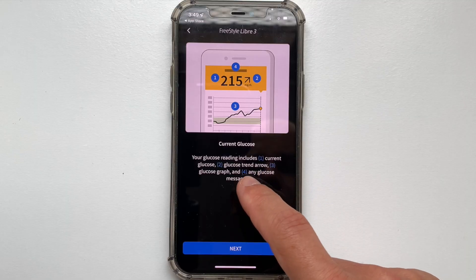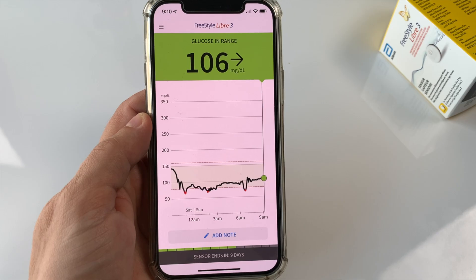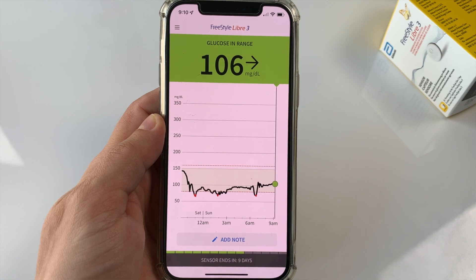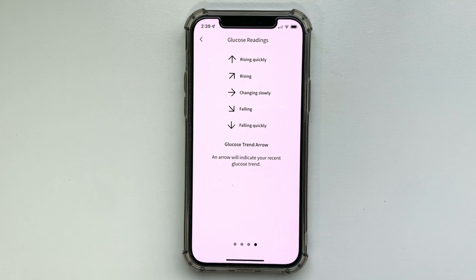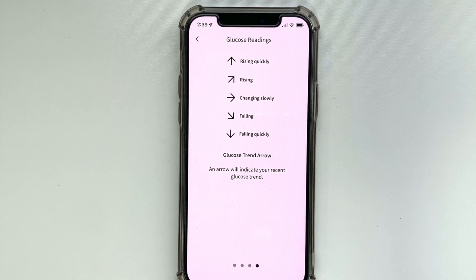The app will remind you that anytime you look at the screen you will see three pieces of information: your current blood glucose number, a blood glucose graph showing what your blood sugar has been in the past 12 hours, and a trend arrow which shows you where your glucose is heading — helping you predict the future trend. On the next screen you will learn how to interpret the glucose trend arrows, which is super important.